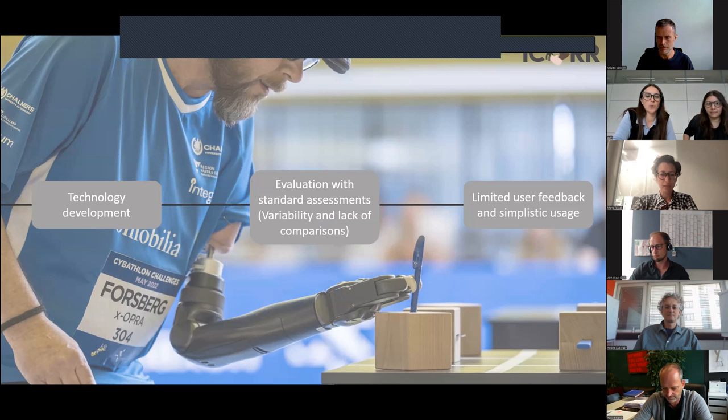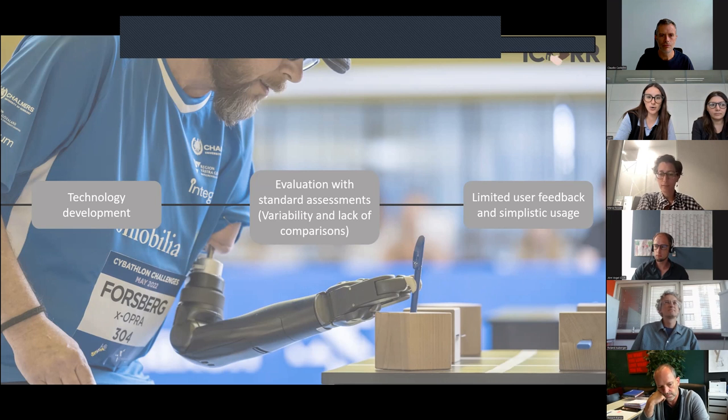As you all know, when we develop multiple technologies during our research, we usually face the problem of how to evaluate them. Often we evaluate them with typical standard assessments that can have a lot of variability in the selection of the assessment, and we also lack comparisons between technologies in the literature. So we often don't fully understand what the main problems with our proposed solution are. And of course, users are mostly involved at the end of the process, in the testing part and not in the design process. And even the use of these technologies is tested only in very simplistic environments.